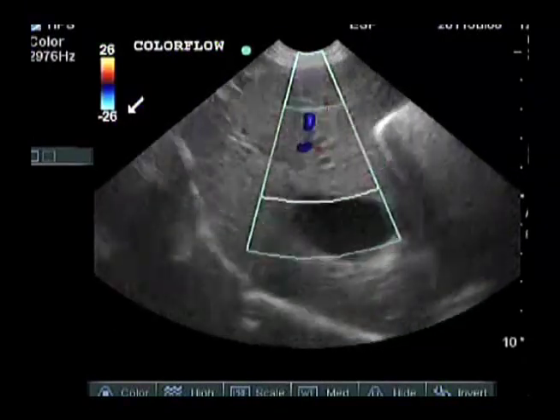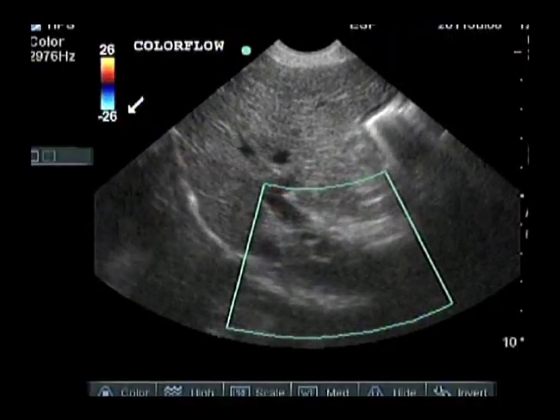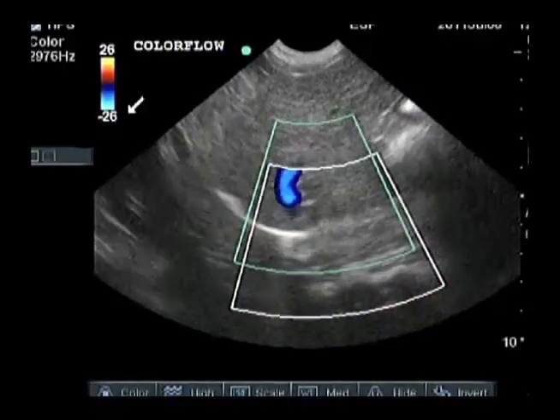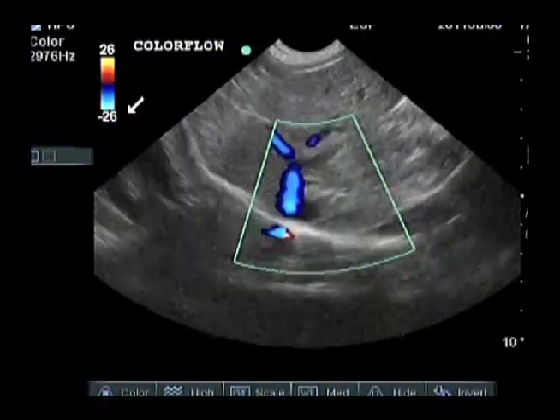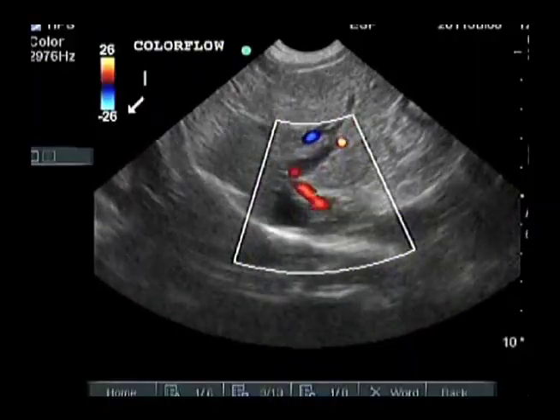As you push the Colorflow box to deeper depths, you may lose color flow. If color flow is important, you may want to switch to a lower frequency transducer or use transducer pressure to press the transducer closer to the vessel of interest.